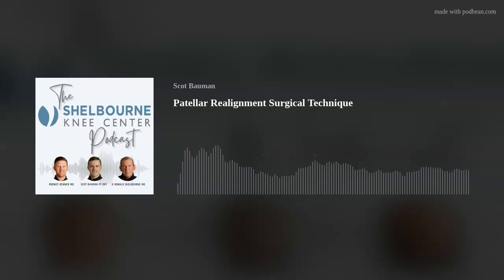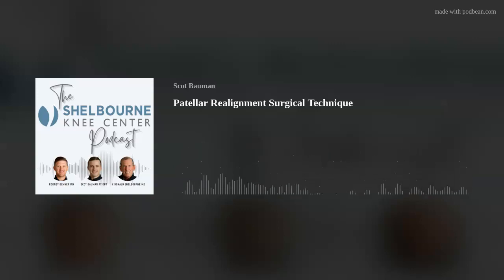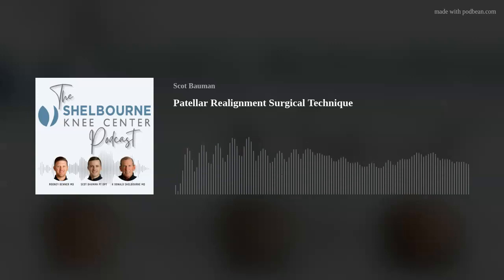And because of that, he started to put a small plate on the tibial tubercle with those 2 screws in it, and then had a resident that suggested, you probably get that to heal better if you put the plate across the fracture site or across the osteotomy site. So then he moved on to at least a 3-hole plate where he had 2 screws in the tibial tubercle and 1 screw distal to the osteotomy. And then the problem with that stress riser kind of went away. So that's been good for us. It's been a good innovation over time and a good evolution of fixation technique to use a plate.